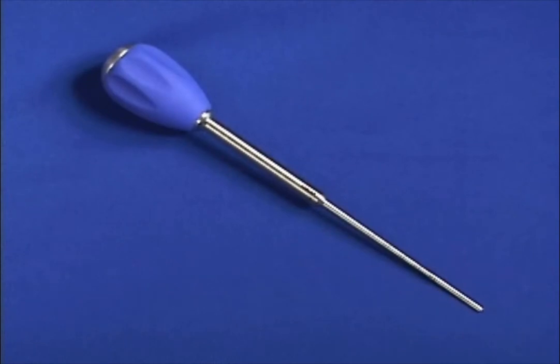The gearshift probe is utilized to prepare a pilot hole prior to screw insertion. The gearshift probe has a curved spatula tip to accommodate technique, depth markings to aid in screw length selection, and an impaction surface.